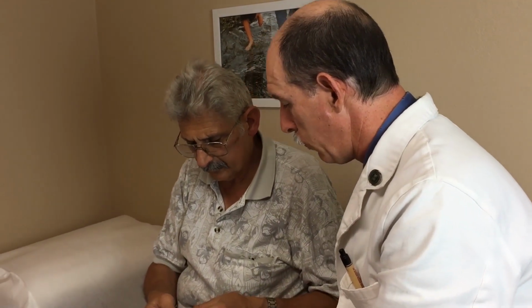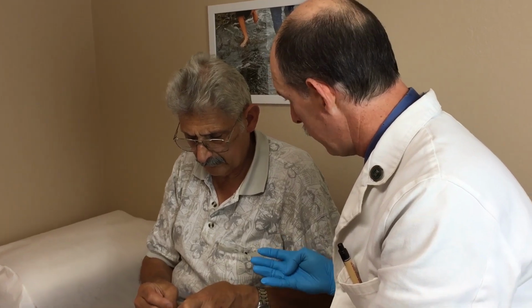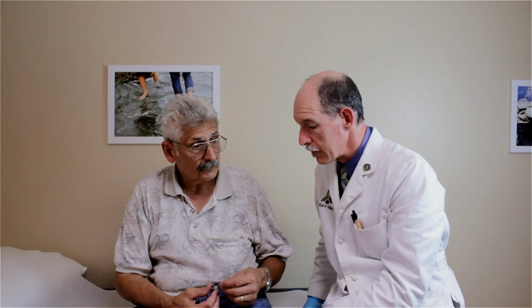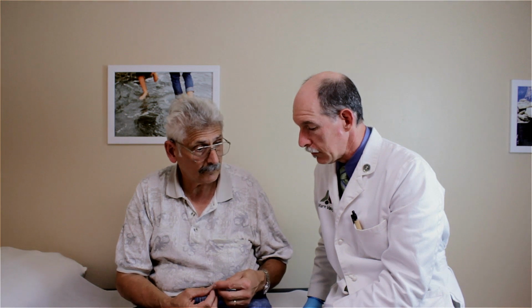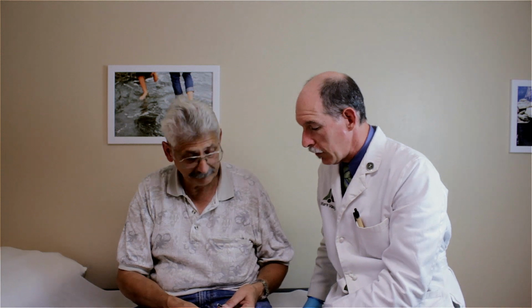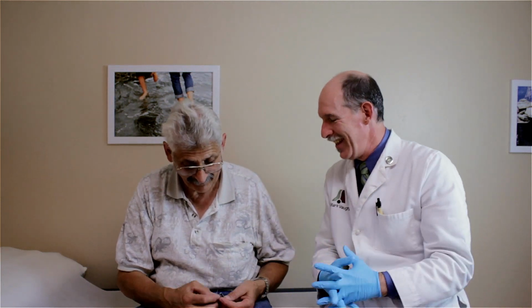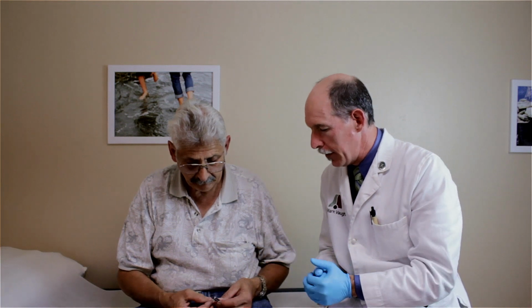Of course, we can always take it out. And if it were to happen on a weekend or something, it's not so uncomfortable that you can't wait. We called and made an appointment, and they made one right away the following day. Good, very good. Just don't get water stuck behind it. Yeah, that would be a problem. So there was a little injury to the canal. It's just bruising. It'll heal up.